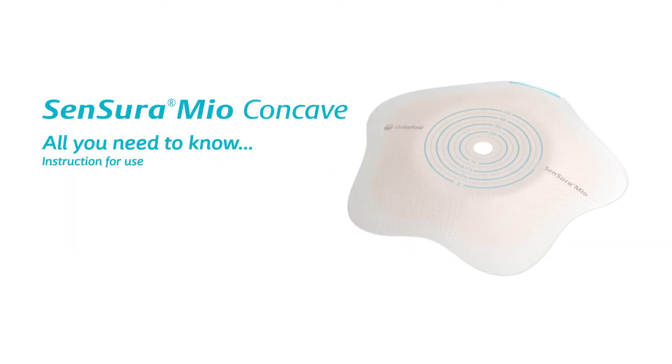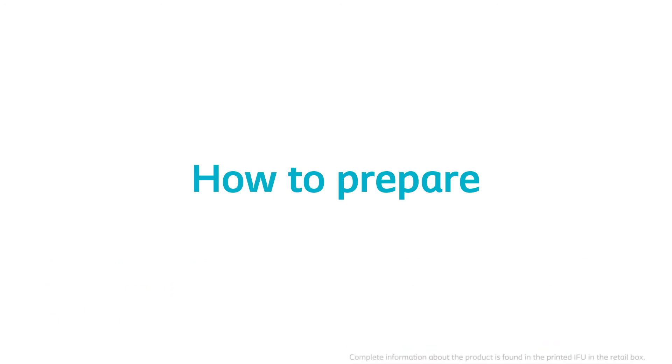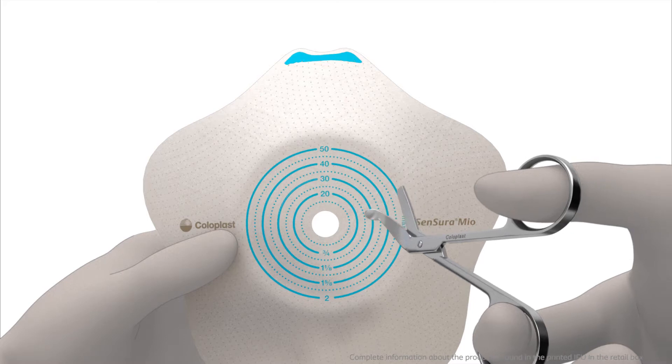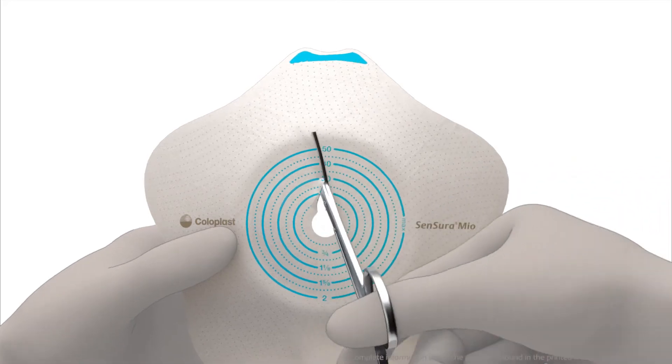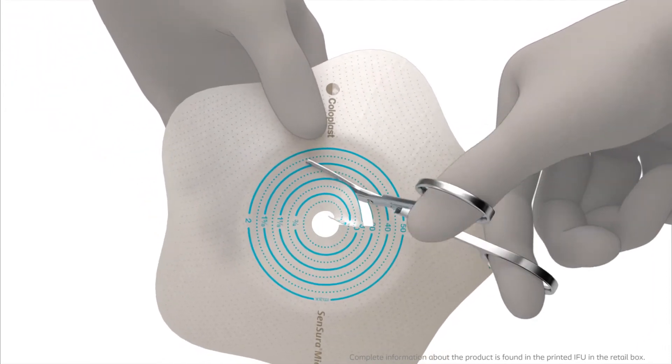Sensura Mio Concave – Instruction for use. Cut a hole in the adhesive to fit the exact size and shape of the stoma using a pair of small curved scissors and the cutting guide of the adhesive.